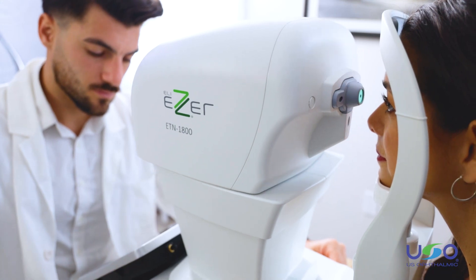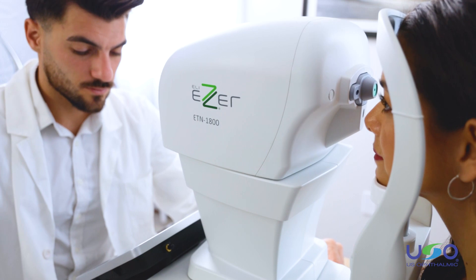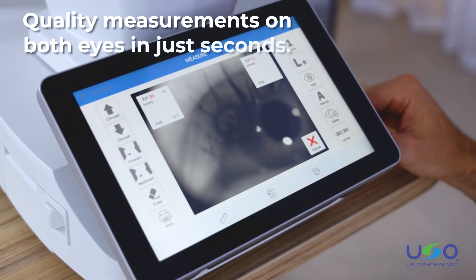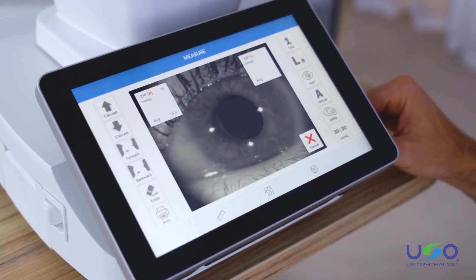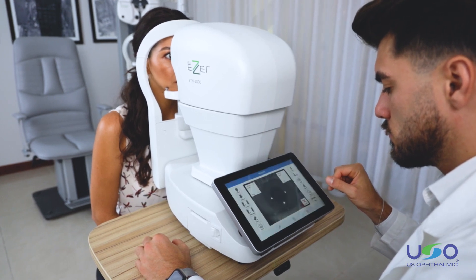As soon as the measurement of one eye is taken, it automatically switches over to begin the process on the second eye. The ETN 1800 takes quality measurements on both eyes in just seconds. Meanwhile, you can relax and watch the ETN 1800 work completely autonomously.